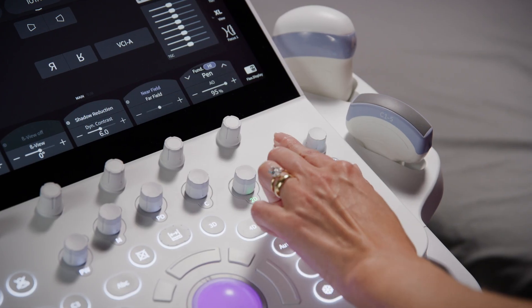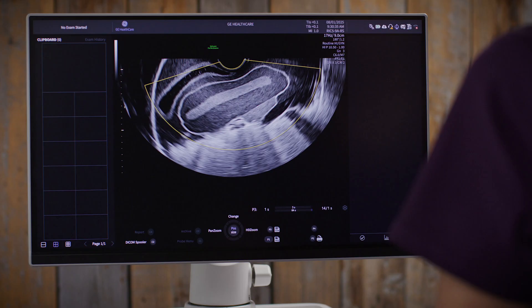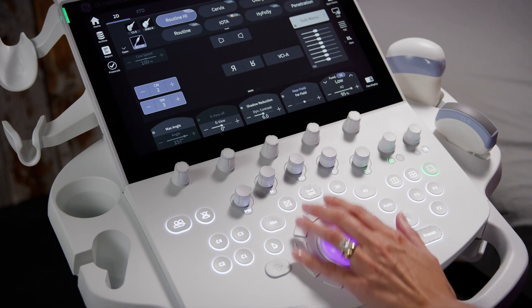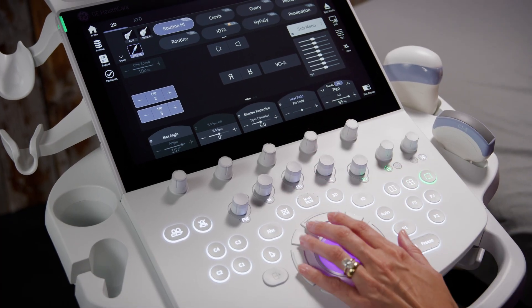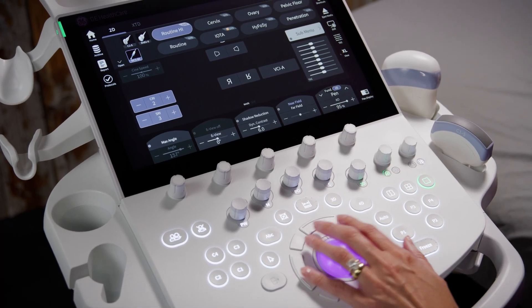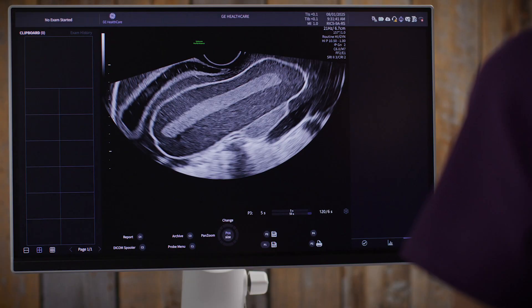We're going to begin with a standard 2D scan. The first step is always to optimize your 2D image. Begin by reducing the box size to focus just on the uterus and adjusting the frequency to penetrate adequately. Then select your auto button to optimize the TGCs automatically, and finally adjust the gain if needed.